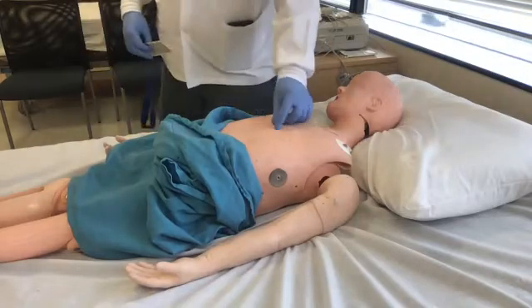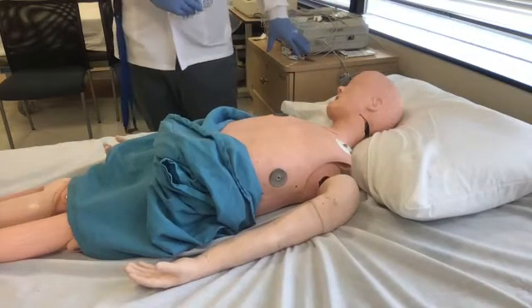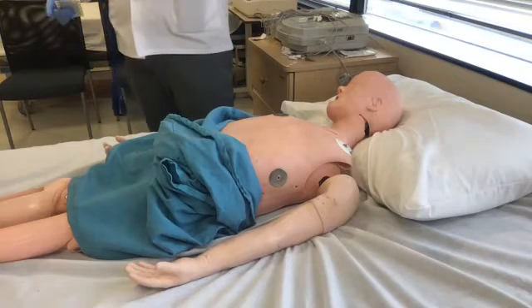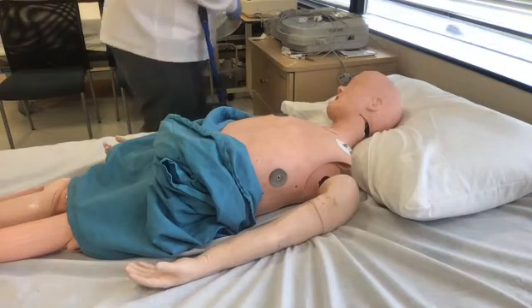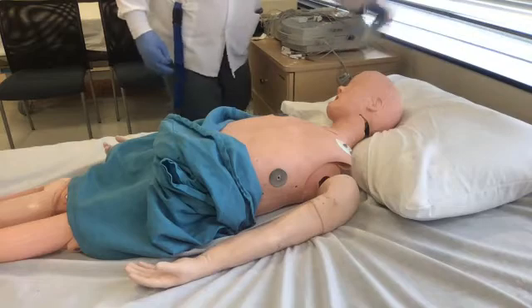But you get a lot of little sticky stuff like this. That sticky stuff will then give you artifacts. You're going to get wandering baseline. Is that a good read? Nope. So you have to make sure these are clean. And you can see here, the seniors before you left it nice and neat. None of these running around.